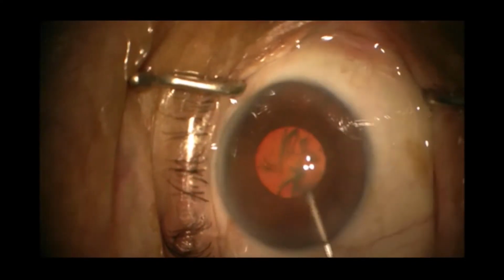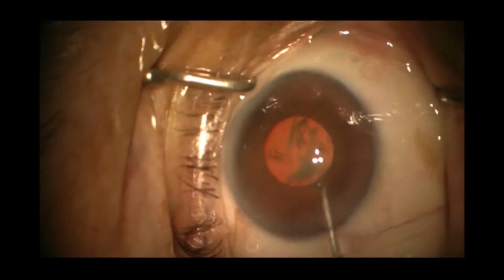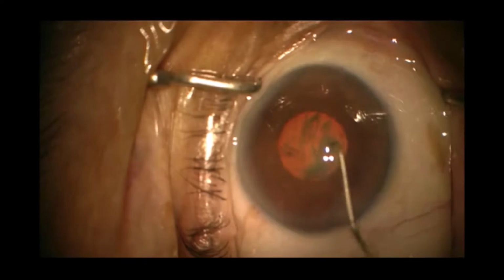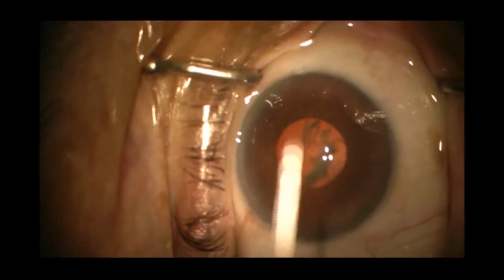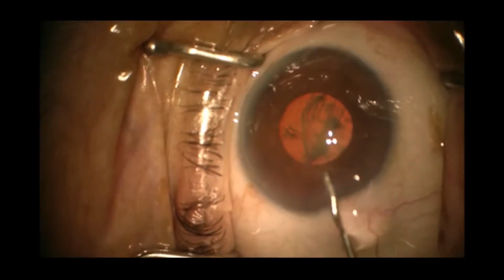to maneuver easily. At any point of time, if I feel that the maneuvering is difficult, I am losing the chamber, we inject more viscoelastic so as to tamponade the anterior lens capsule and prevent the rhexis from running to the periphery. So I right now inject more viscoelastic.